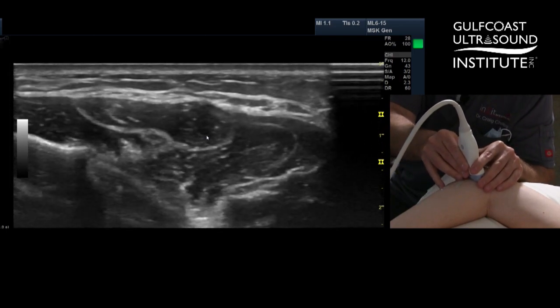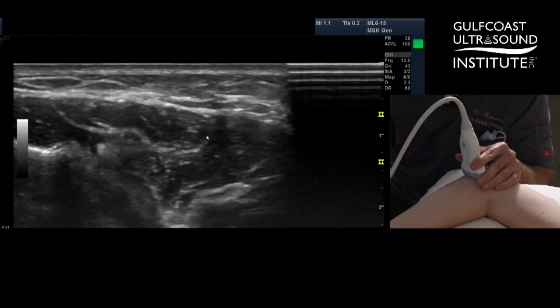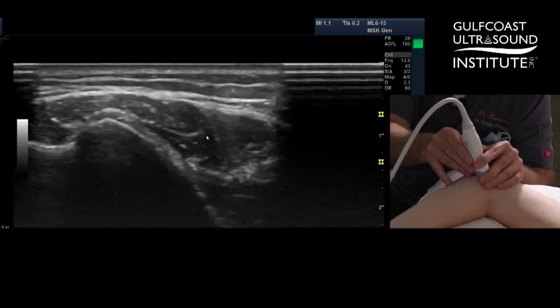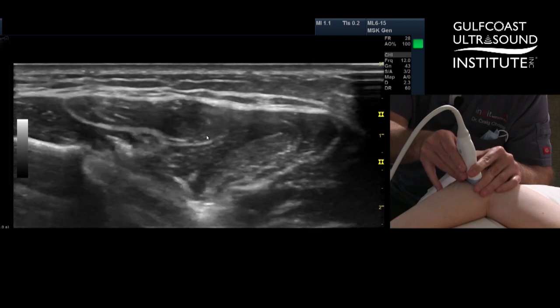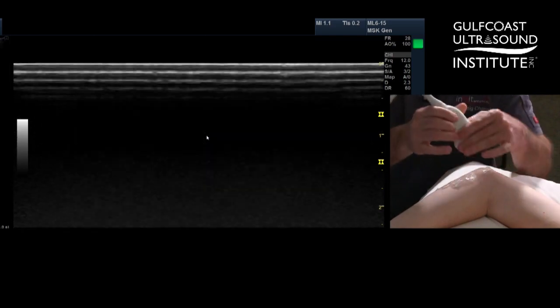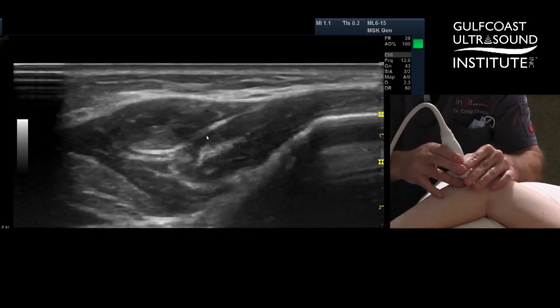I believe that there it gets swollen again, that at this level, just basically distal to the cubital tunnel or that Osborne's ligament or fascia, that it got injured or laid on. So we're going to inject this spot and see if we can get that to feel better. I'm going to change the probe direction right now because I want my needle coming in from the right side.